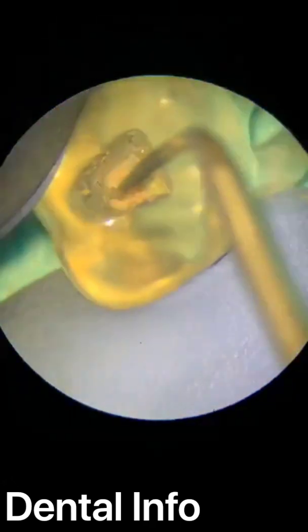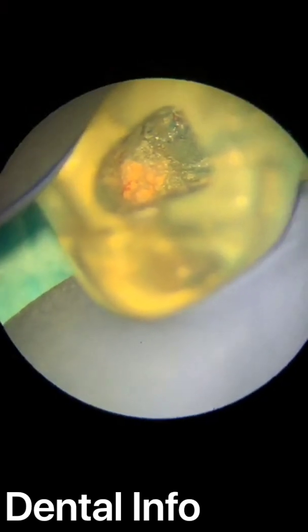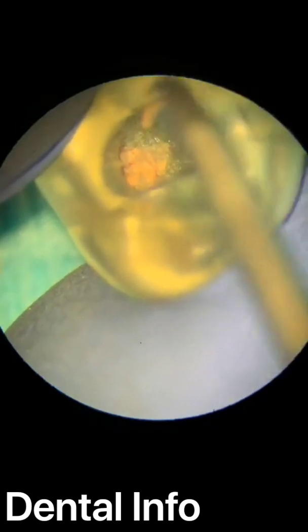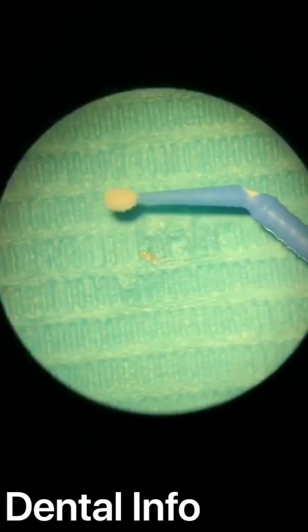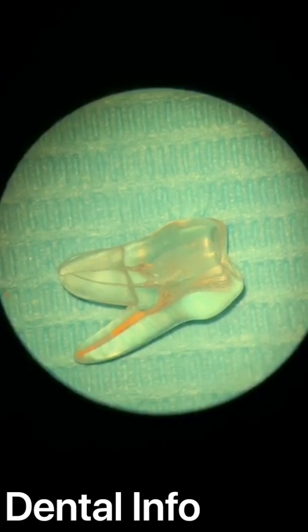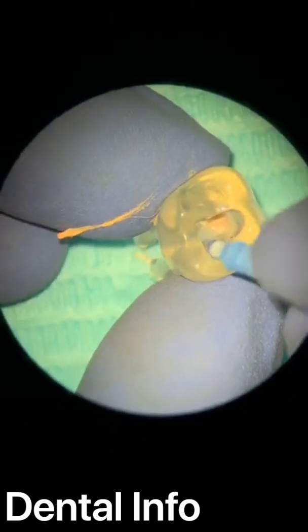Okay. Before I finish my demonstration, I just want to give you a nice trick: how I'm cleaning the chamber after I finish my obturation. I'm bringing my micro brush, it's a bond brush, you see, and I'm dipping it in alcohol, like 76% or 99% alcohol. See, it's wet now, and I clean my chamber here with alcohol.